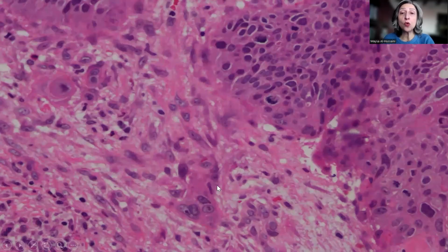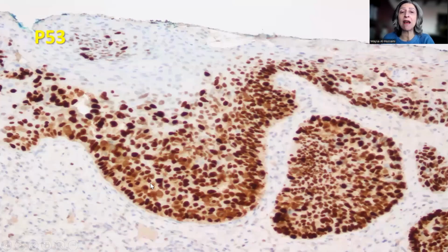subepithelial tissue. And more so here as well, this tongue is extending, separated almost completely from the overlying basophilic or more bluish colored carcinoma in situ, to become more acidophilic, more pinkish in color, and there is one cell here with the prominent nucleolus and then with the surrounding desmoplasia. Very useful tip for the identification of early invasive carcinoma.